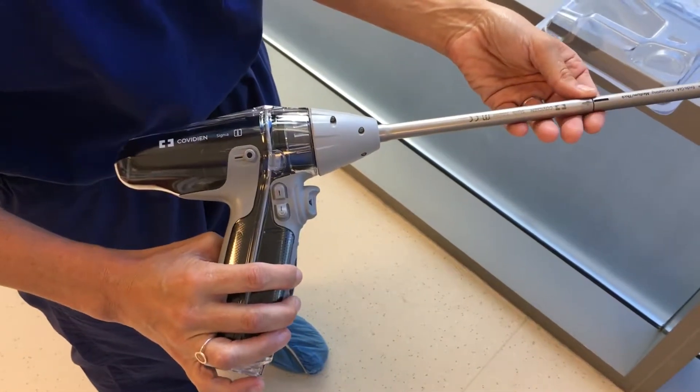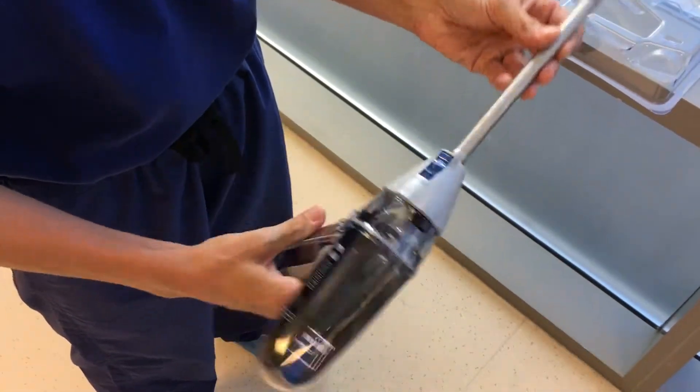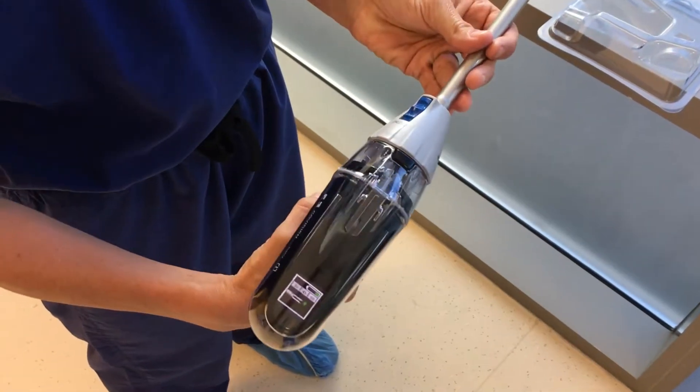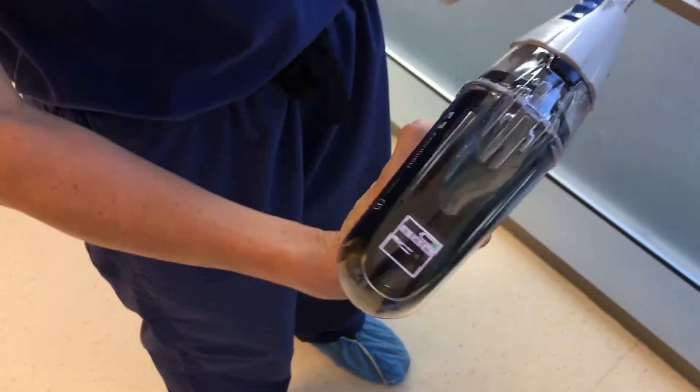This is the Signia powered stapling system that Dr. Graney is using. What you'll notice is that you have an LED screen in the back that's telling you every control for opening and closing.